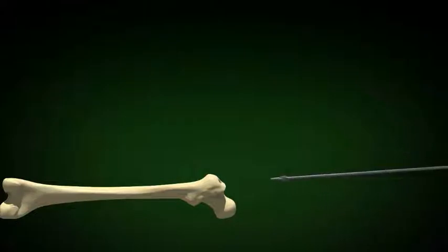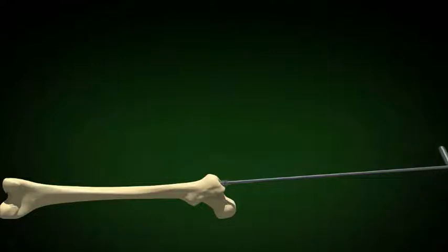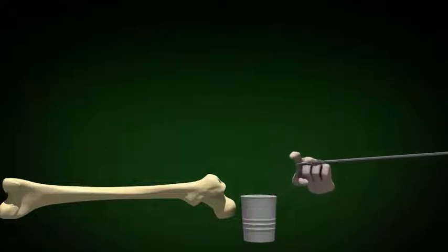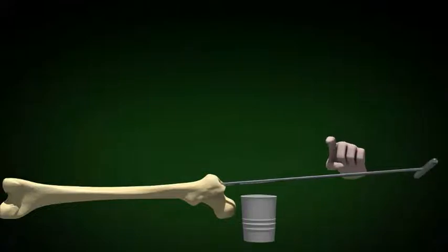This is the blunt nose reamer, which can follow the tract. Ream until chatter about 4 centimeters in the isthmus. Choose a nail 2 millimeters smaller than the reamer that caused that chatter. Save the bone from the flutes of the reamer and use your gloved finger rather than an instrument to remove it.